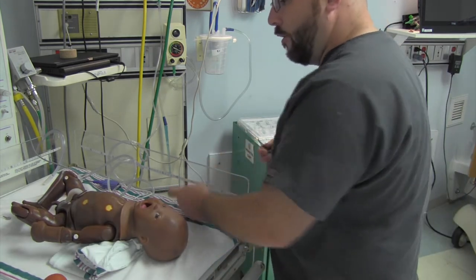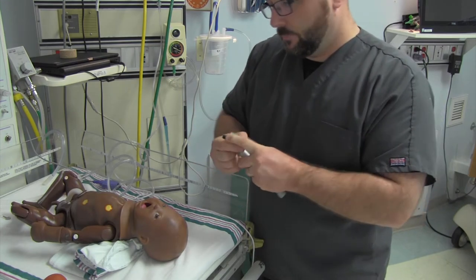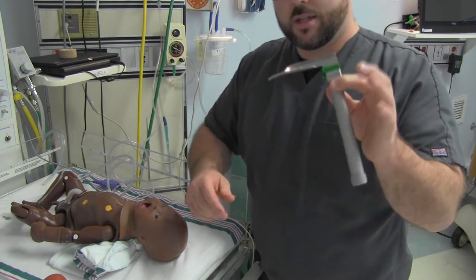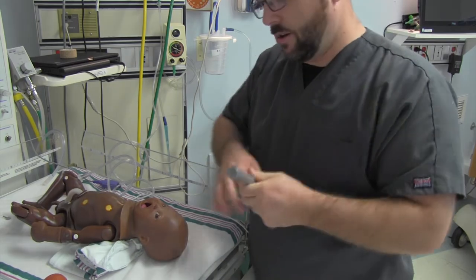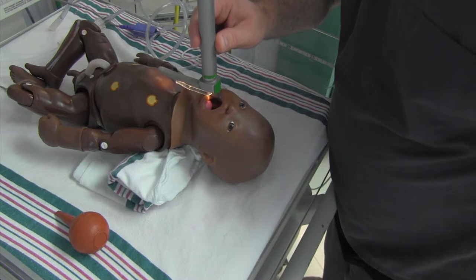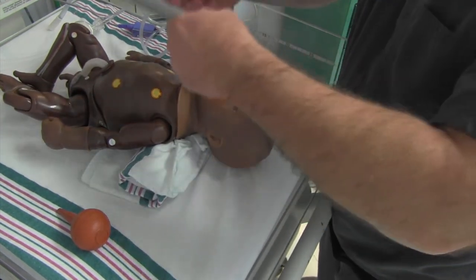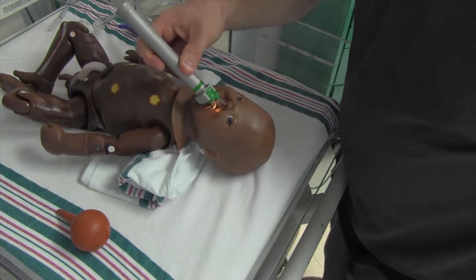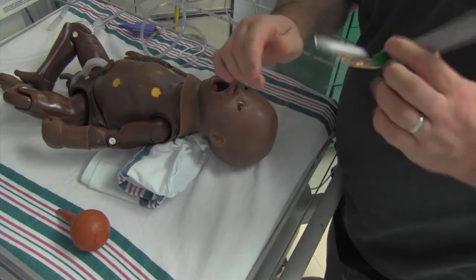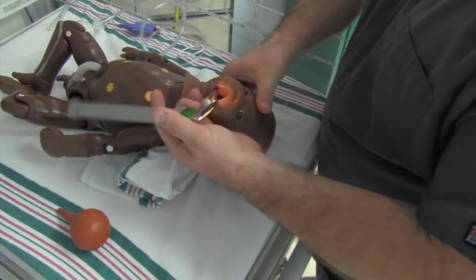Let's go over intubation now. I'm going to show you how to do it with a one blade, which is way too long - that thing is going to be like all the way down the airway if I bury it. So with all intubations, you only use what you need of this blade. Just because it's this long doesn't mean I have to use it that way. You only use the tip.